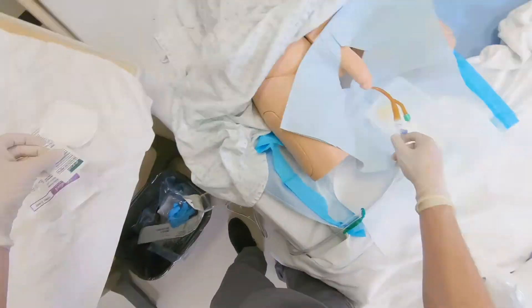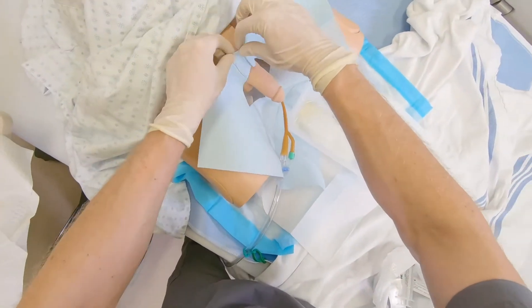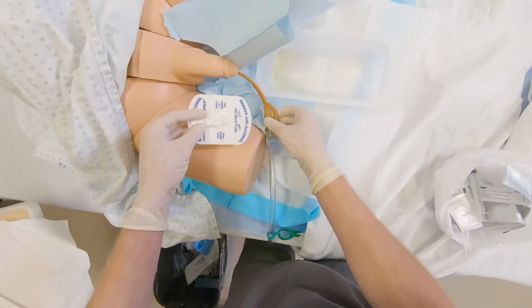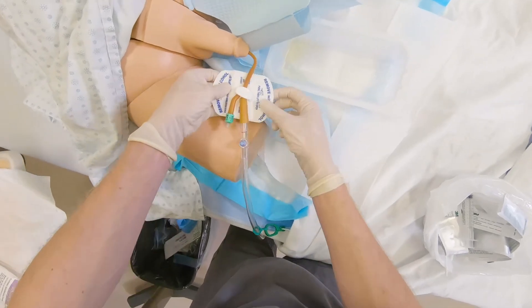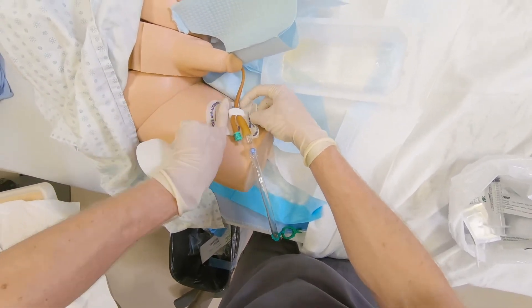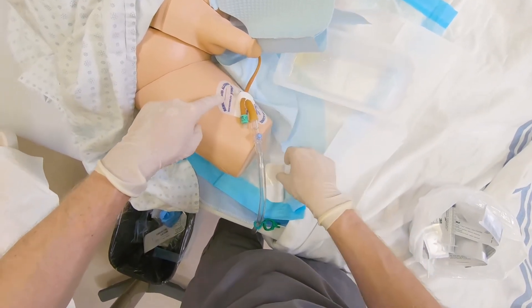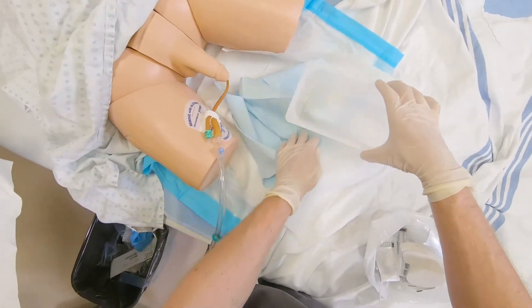Prepare skin using skin wipes from securement package. Remove fenestrated drape by ripping one side. Place catheter into securement device and apply securement device to where area has been prepped. Ensure there is slack in the catheter tubing to form an S shape. Remove used supplies and perform peri care.